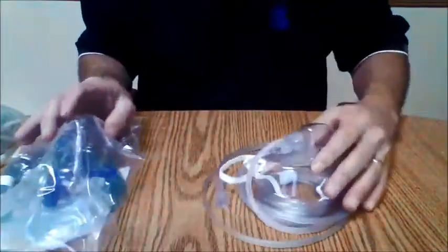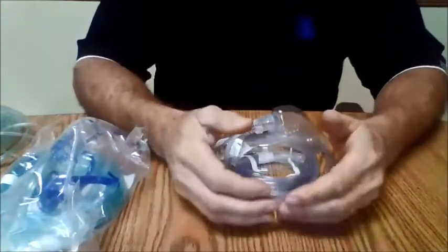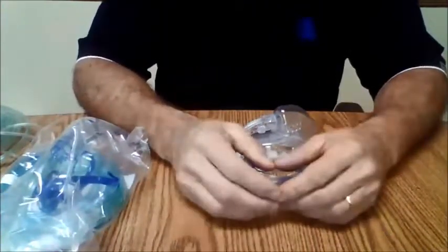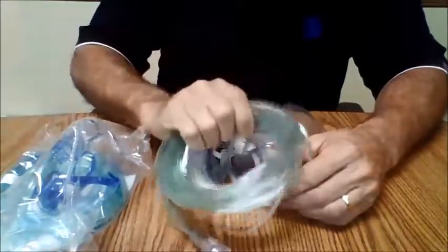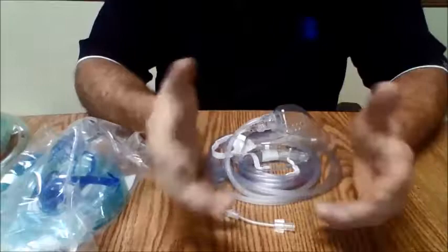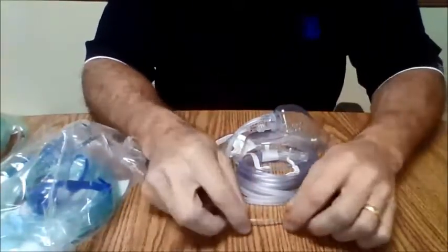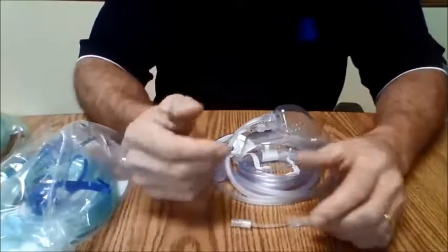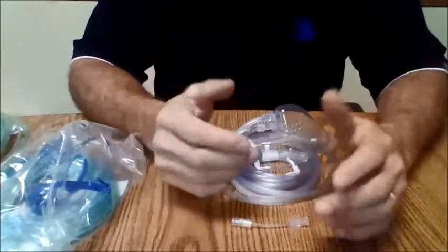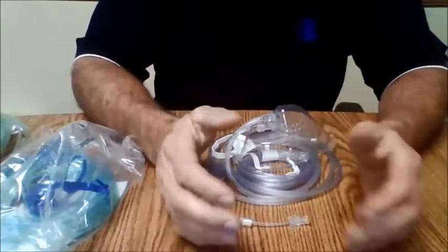When we get to our MAC anesthesia, which is generally what we're doing for most clinicians when they do a procedural sedation, they'll start with a nasal cannula like we talked about, and that might be all they need. But if the patient's obese or they're having trouble oxygenating the patient, sometimes a nasal cannula, which only generates in the 30% range of inspired oxygen, isn't enough, and they need more control over their oxygen.